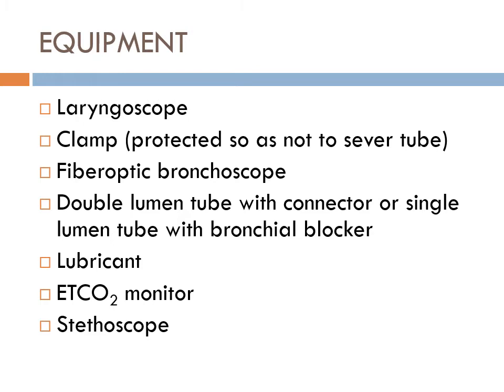So what you would do is you put a normal breathing tube in, just like anyone else. Same exact process. Once that tube's in, in this case with this bronchial blocker, you can pretty much just thread this through the tube, take off the plastic housing though.